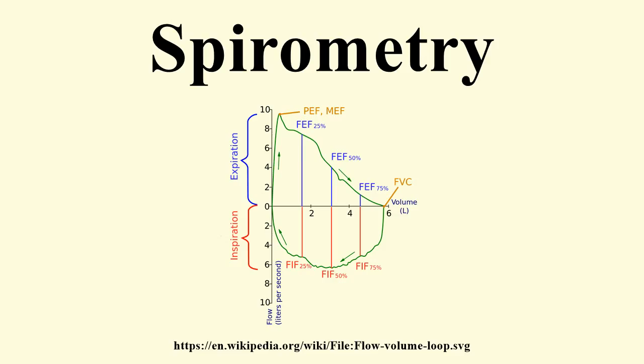Average ranges in the healthy population depend mainly on sex and age, with FEF 25–75% shown in diagram at left. Values ranging from 50 to 60% and up to 130% of the average are considered normal. Predicted normal values for FEF can be calculated online and depend on age, sex, height, mass and ethnicity, as well as the research study that they are based on.